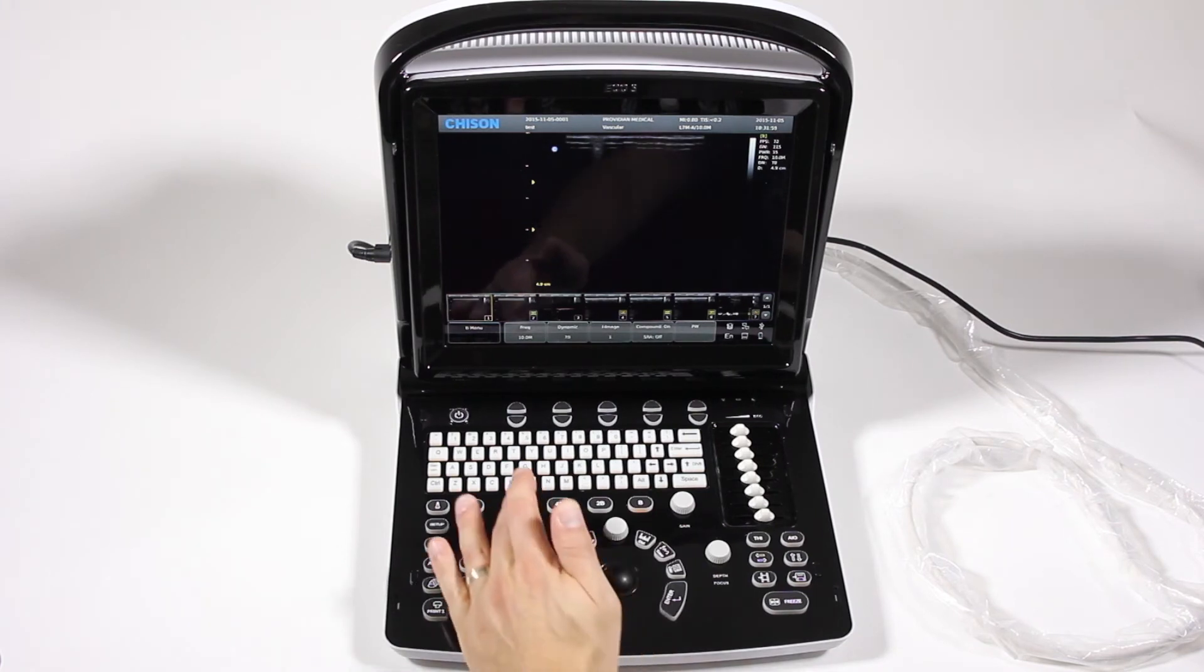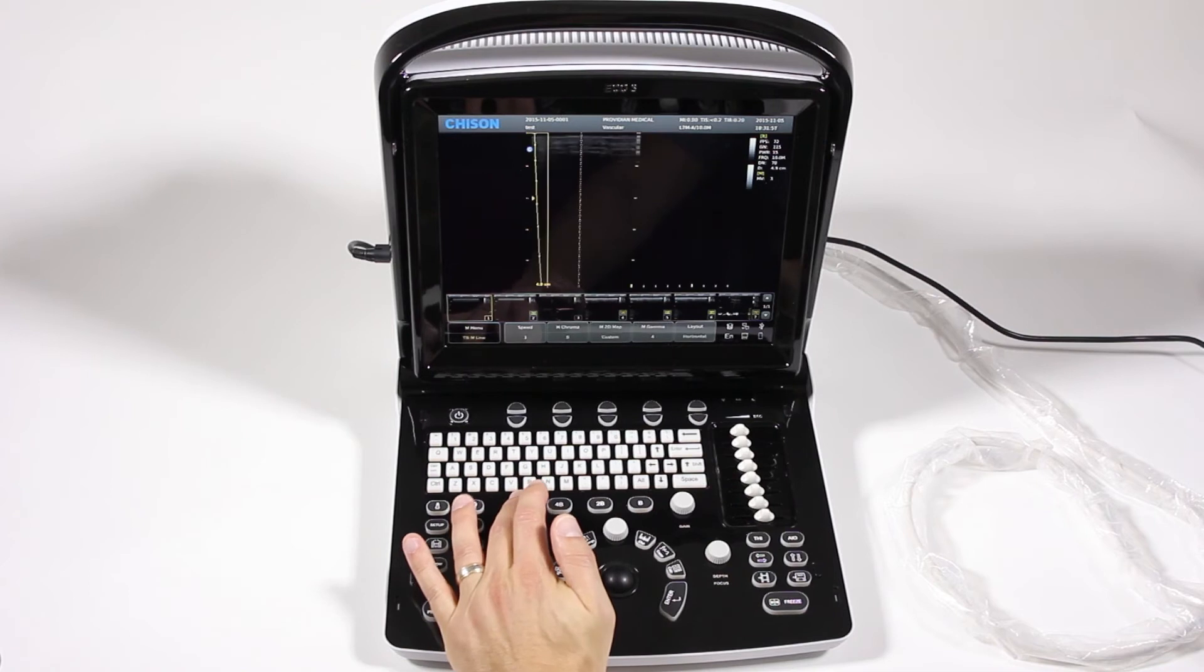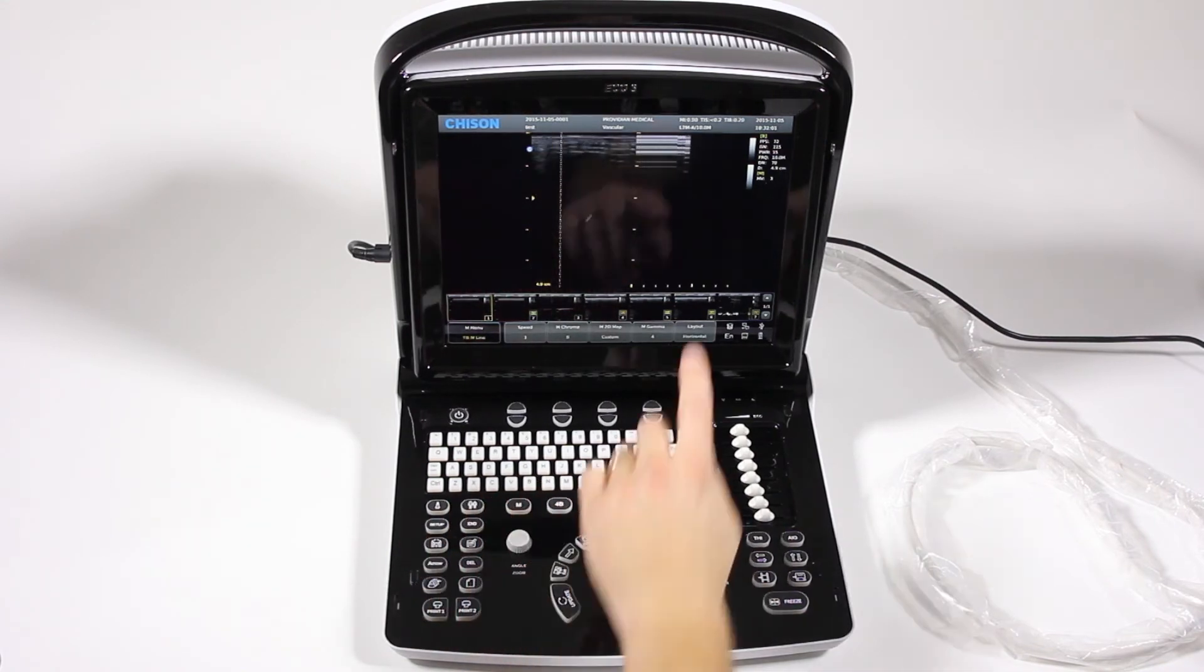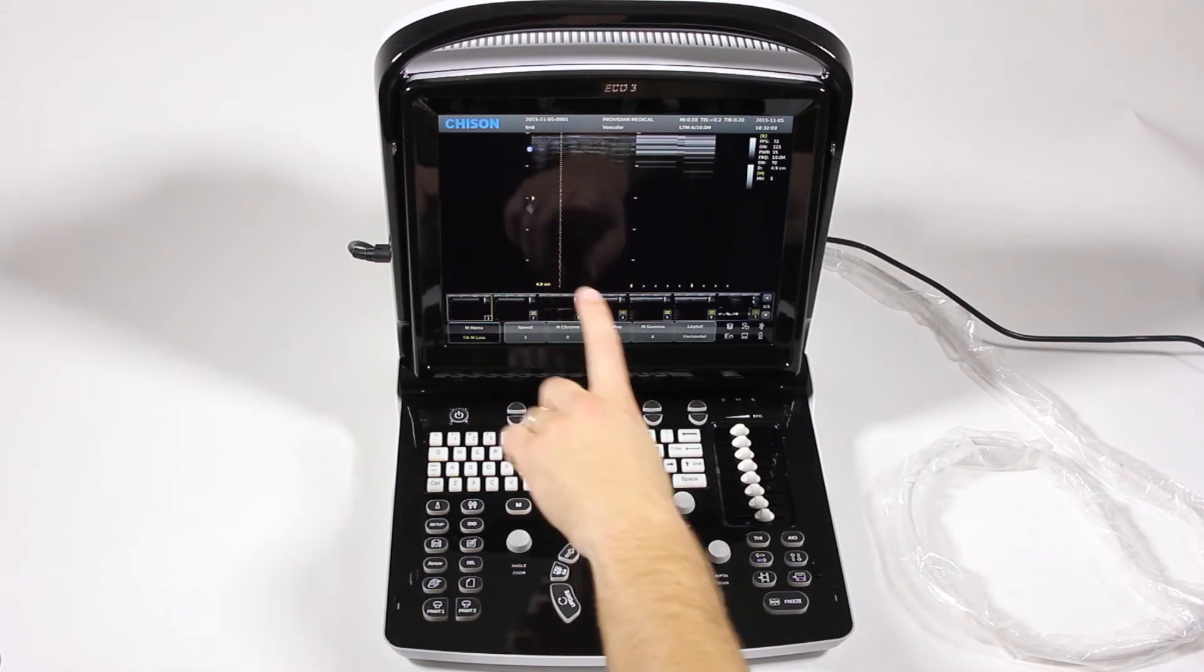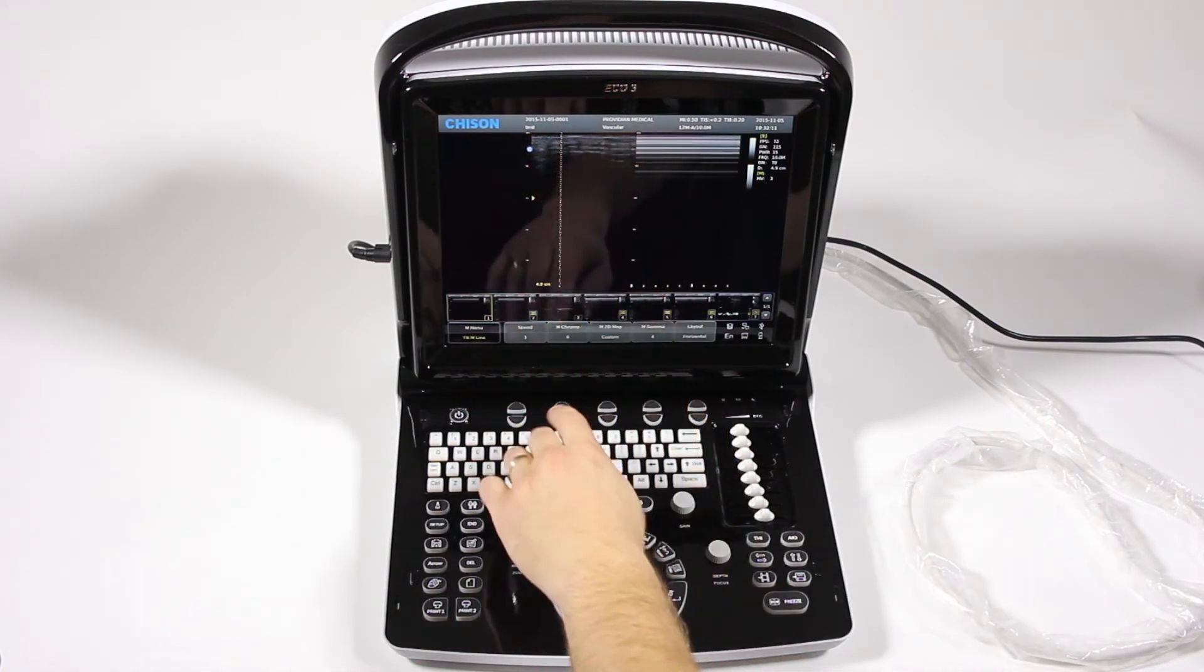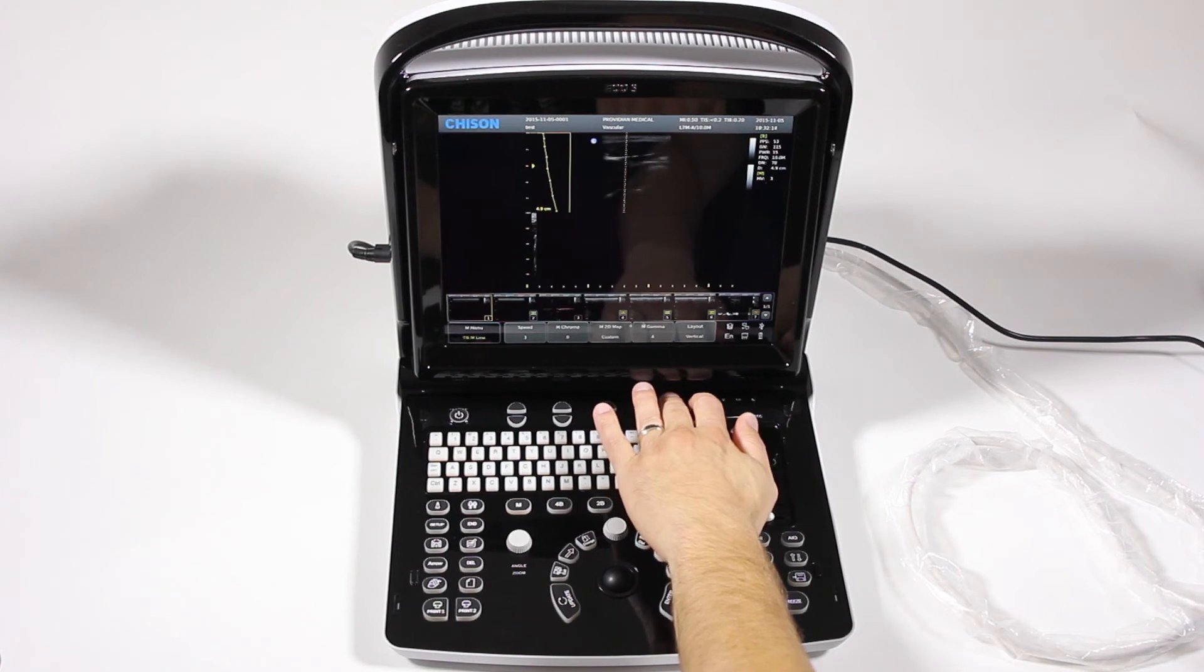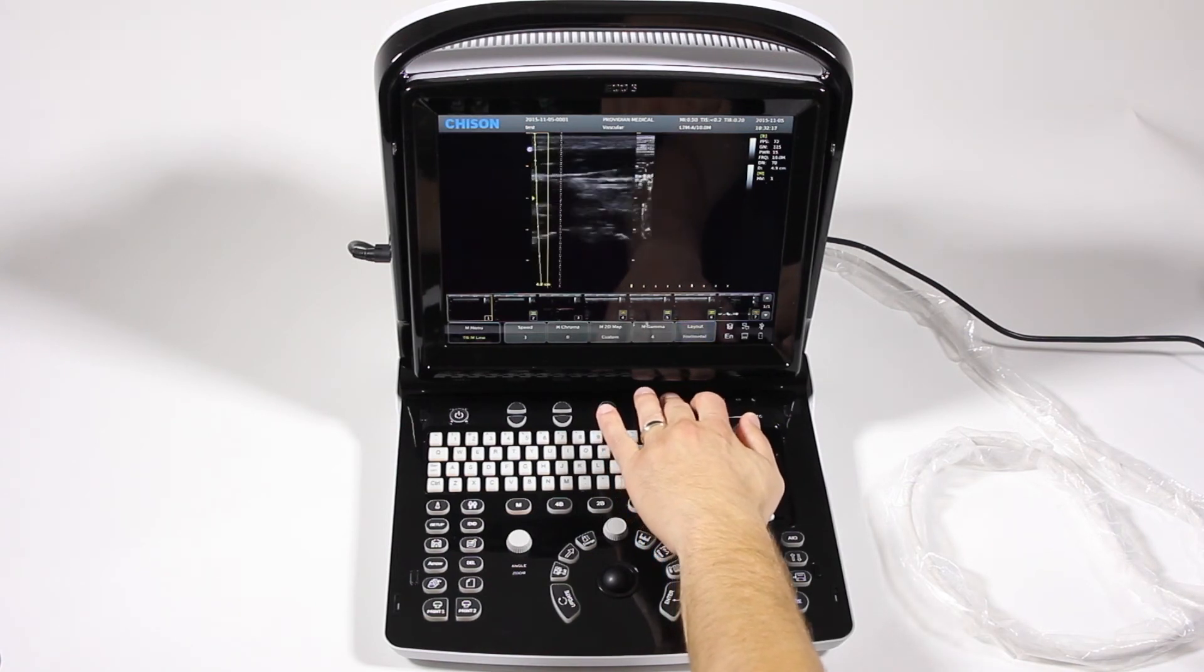M mode works very much the same way. You're just going to hit the M button, and you're going to get your line. And it's going to be a split screen up here. You can choose the layout to change how it appears on the screen.